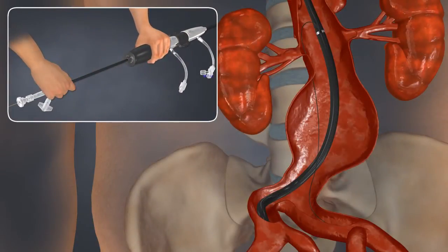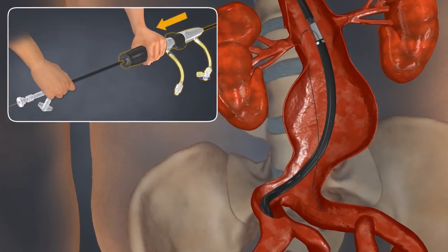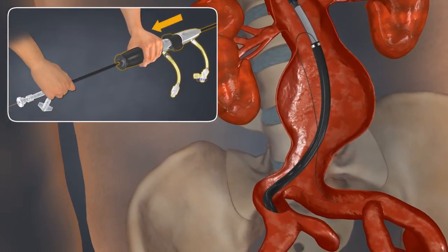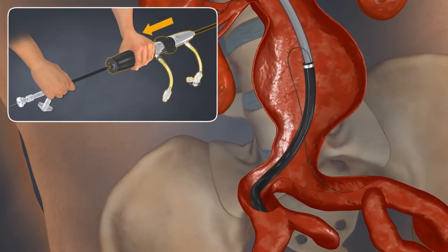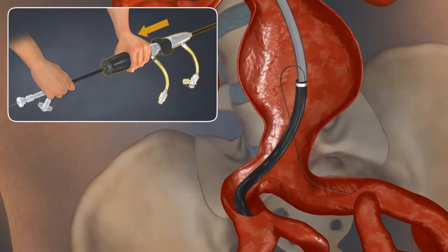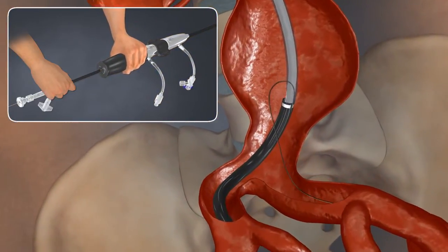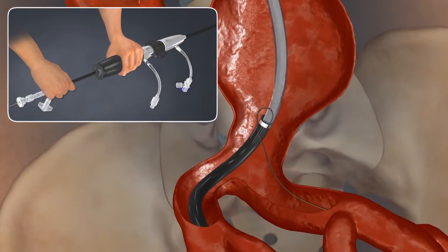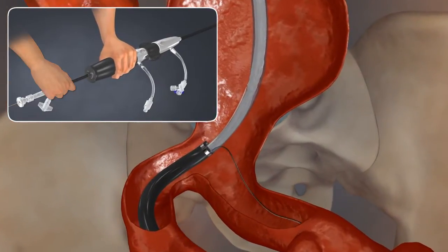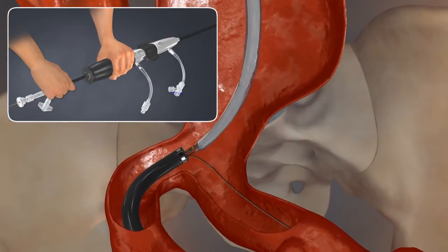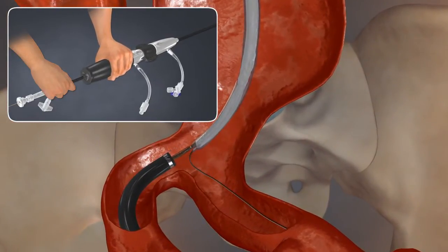Pin the inner core and pull back on the delivery system handle. This motion exposes the covered stent graft. Continue pulling the delivery system handle until the end of the introducer sheath is just below the aortic bifurcation.